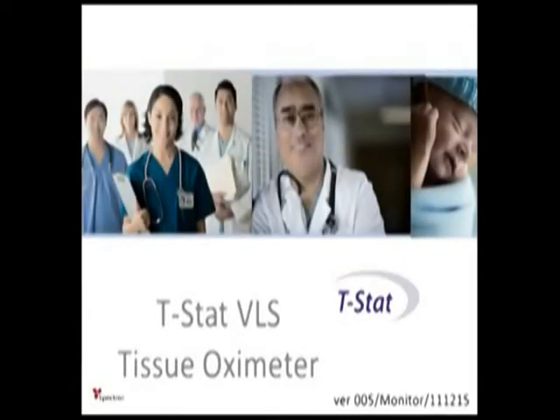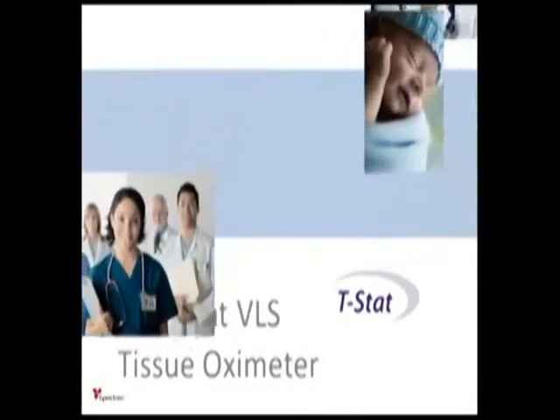Introducing the revolutionary T-Stat VLS tissue oximeter from Spectros.